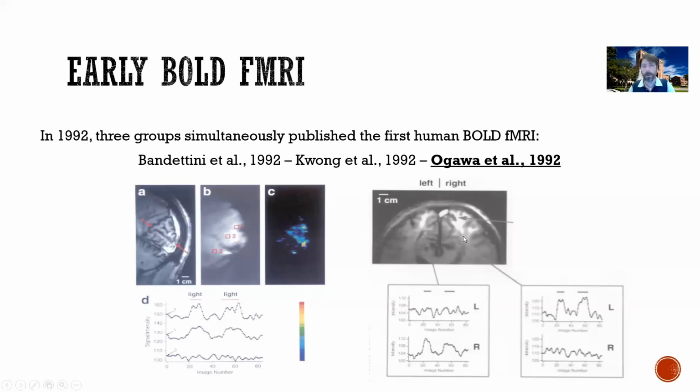If you look in the right cortex, in the right hemisphere, you get the exact opposite pattern. When you stimulate the left eye, you get exactly what you'd expect: baseline, turn on the stimulation, big response. Turn off the stimulation, it goes back down to baseline, until you turn on the stimulation again, and it comes back. The signal becomes strong again, turn off the stimulation, the signal dies off again.